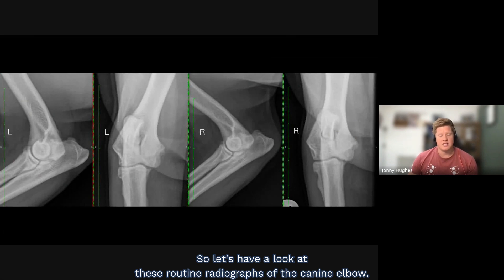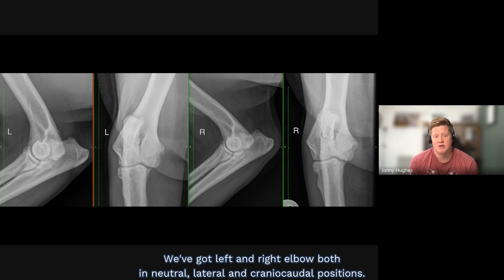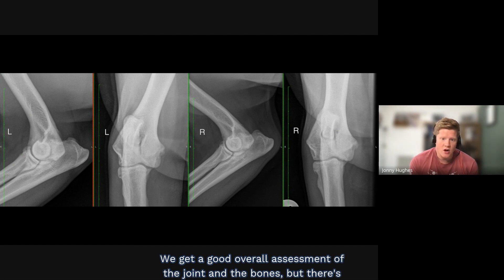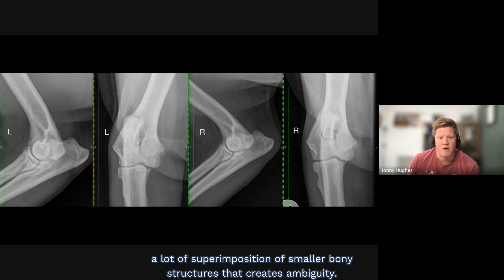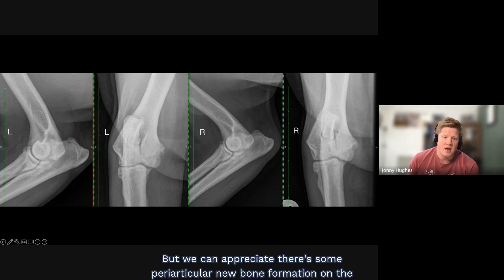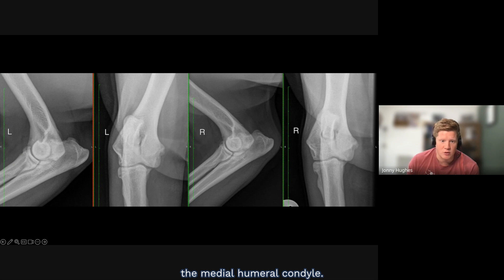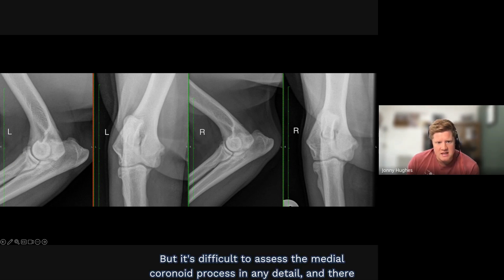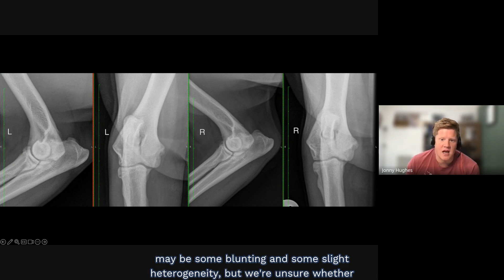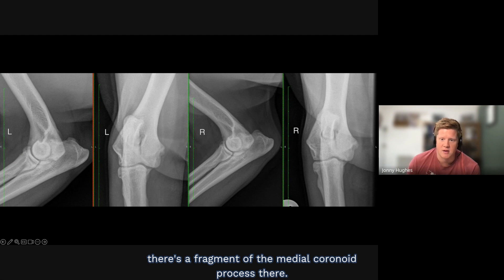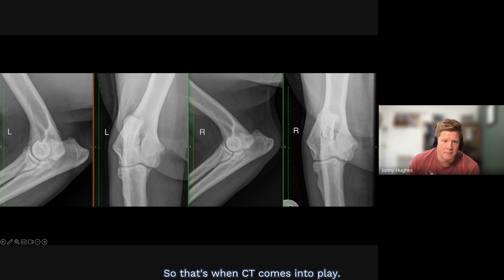Let's look at these routine radiographs of the canine elbow — left and right, both in neutral lateral and craniocaudal positions. We get a good overall assessment of the joint and bones, but there is significant superposition of smaller bony structures that creates ambiguity. We can appreciate some periarticular new bone formation on the cranial radial head and anconeal process in both cases, and some remodeling of the medial humeral condyle. However, it's difficult to assess the medial coronoid process in detail, and we're unsure whether there is a fragment there. That's when CT comes into play.